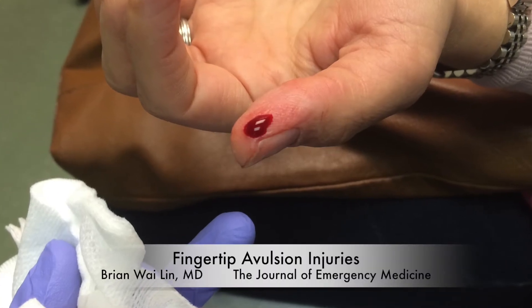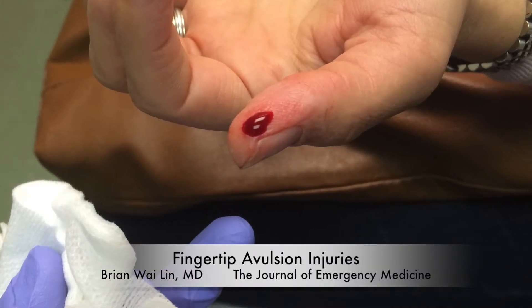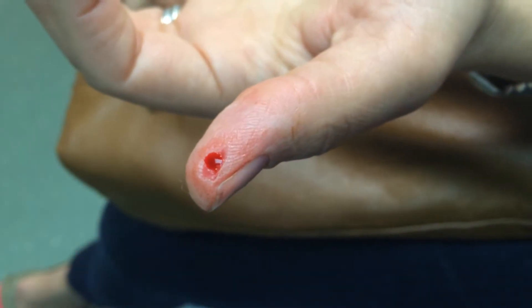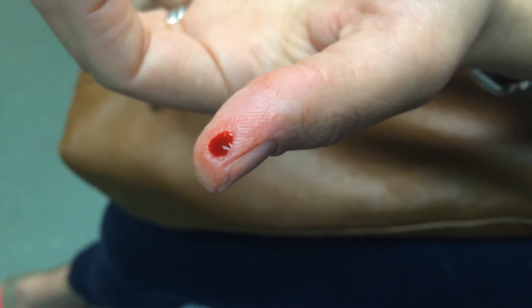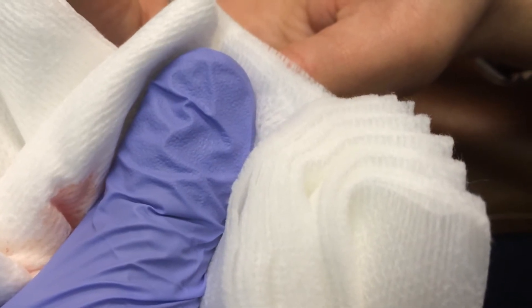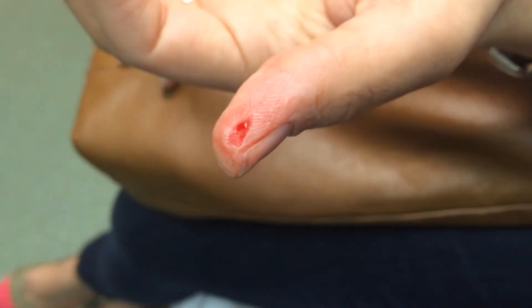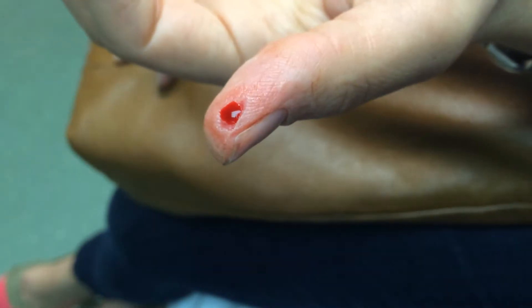In this video, I'd like to demonstrate a simple technique for management of fingertip avulsion injuries. These are a common injury that we all see in the emergency department, usually a person who slices the tip of their thumb or another finger while they're slicing vegetables. No matter how much direct pressure you hold on these injuries, they just keep bleeding, and this is a real nuisance, which is why the patient comes to see us in the ED.